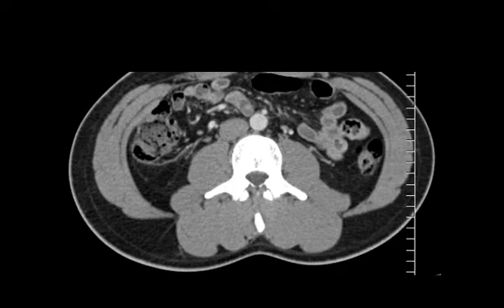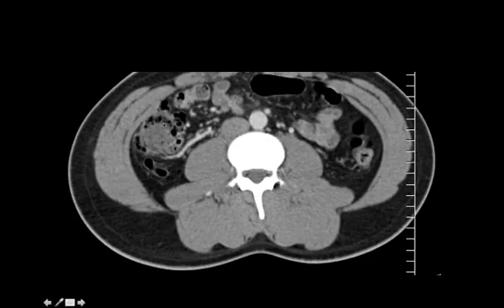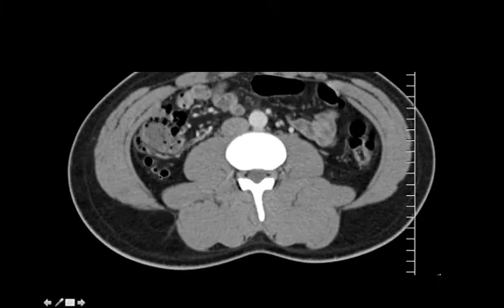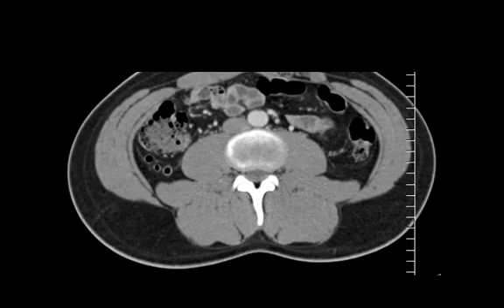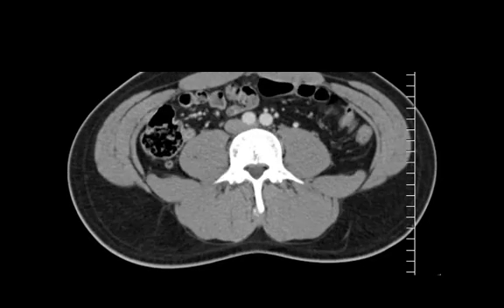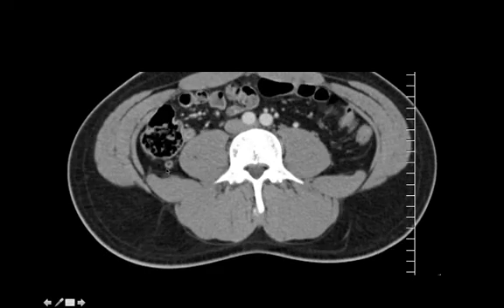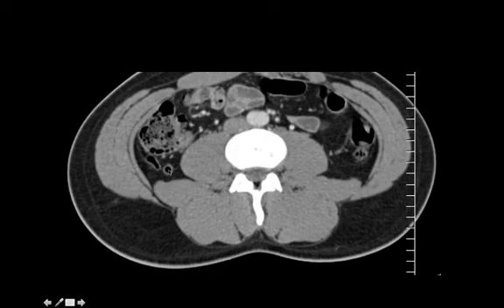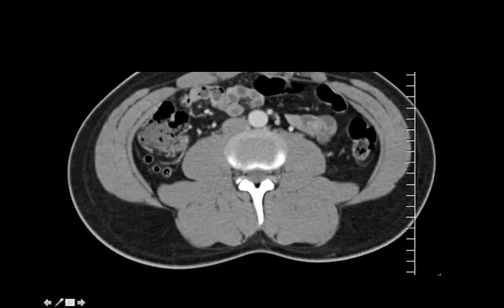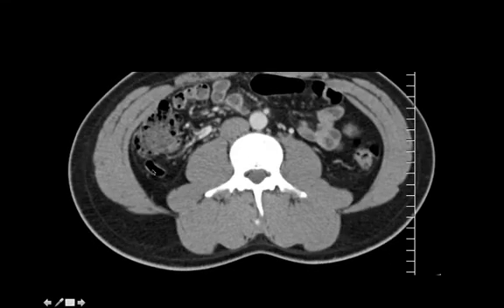Here I have another example. The ileocecal valve is not included in this picture, but here you'll see an appendix — and there it is. It's very well defined, the walls are thin, it's tubular, it's full of air, and the fat around it is not inflamed. The point I want to make is that it stays behind the cecum the entire time — this is a retrocecal appendix.